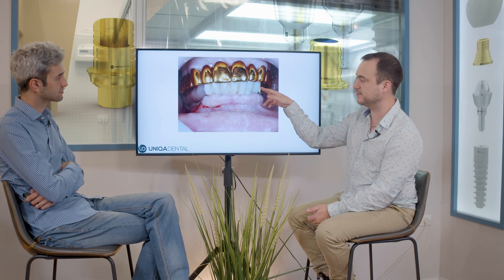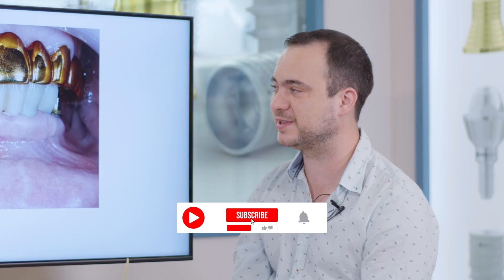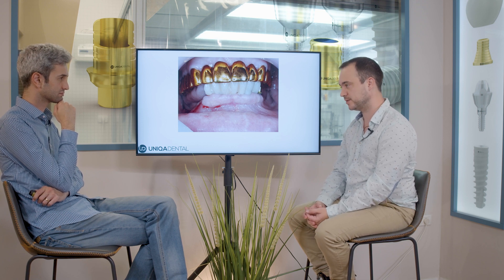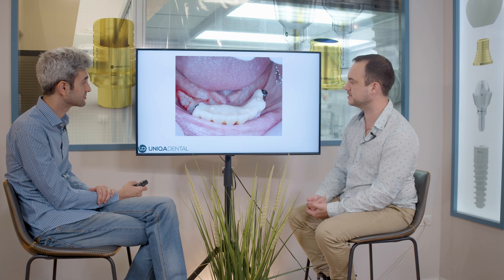You can see that she has a sleeve on top of the implant because she broke the crown on the sleeve. She grinds her teeth very hard and she always breaks down some of the restoration. I'm sure the upper metal teeth don't help in this situation. They don't help — they wear off everything that we do, even the healing caps. It won't wear out zirconia, but all the temporal bridges are made from PMMA and not from zirconia, so it can break and wear the PMMA. Even the healing caps we had before — it just wore off the healing cap and there were no hex on the healing cap in the end. You can see everything is breaking down on both sides, and this is due to her grinding.